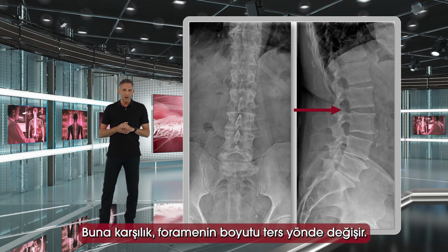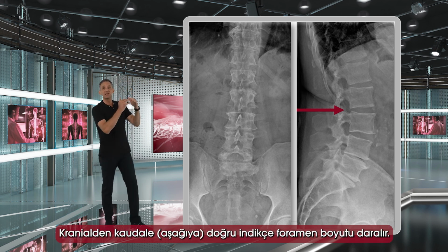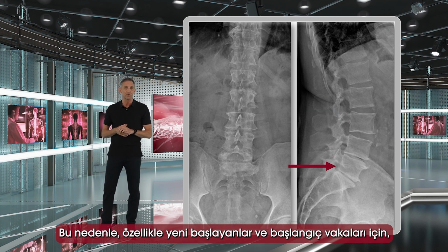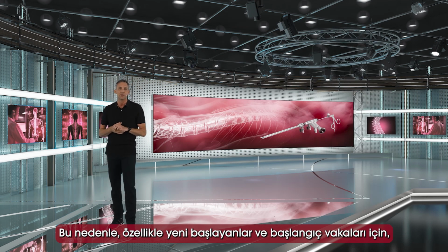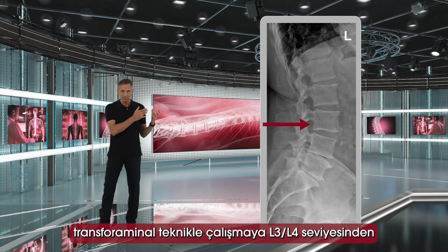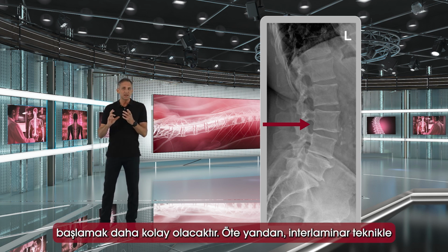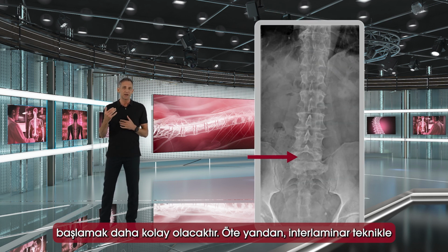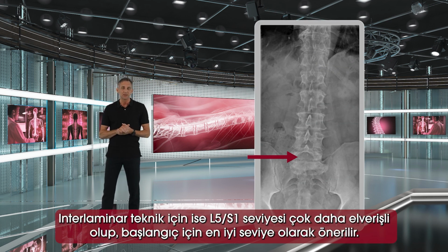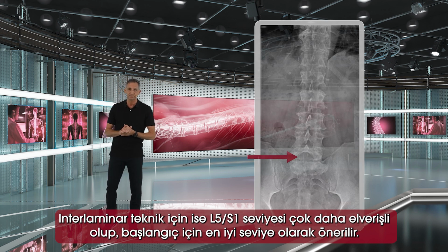This works the other way around for the foramen. So conversely, the size of the foramen decreases when you're going from cranially to caudally. And this is why you will find it easier, especially for beginners, for the transforaminal technique that you start at the level L3-4, for example, whereas it's much easier for L5S1 to start as a starting case when you start working with the interlaminar technique. So L5S1 would be really the best level to start with for beginners.